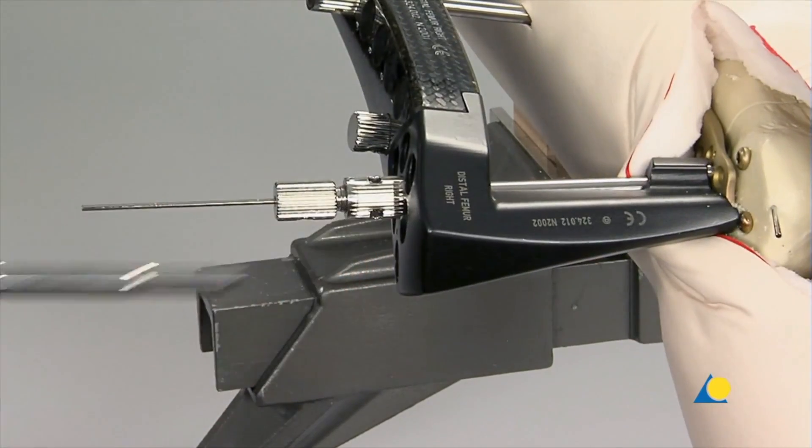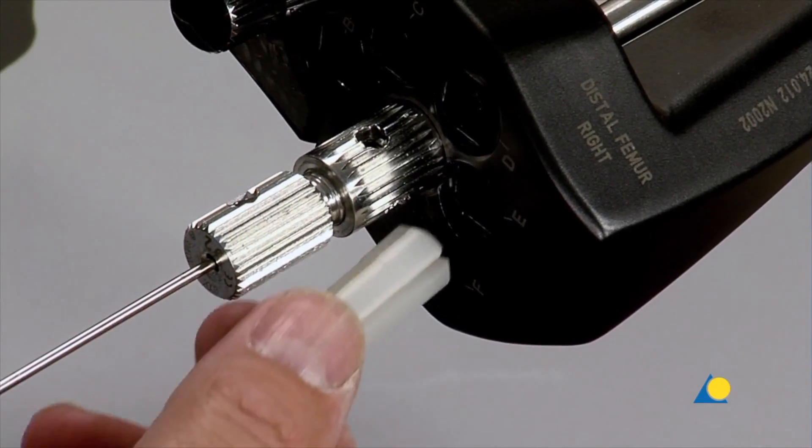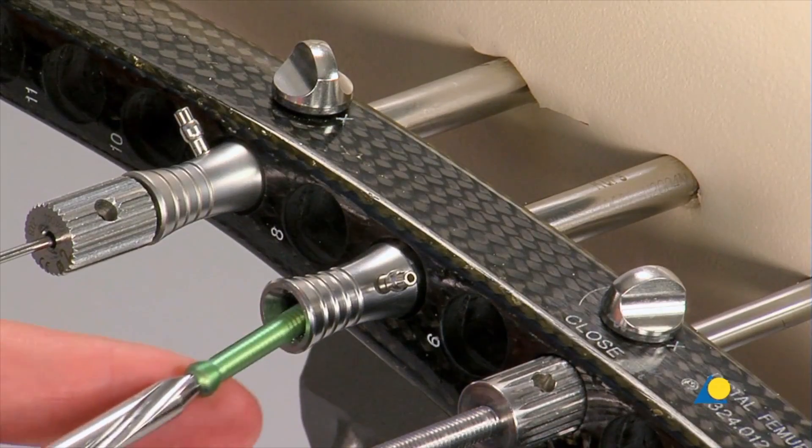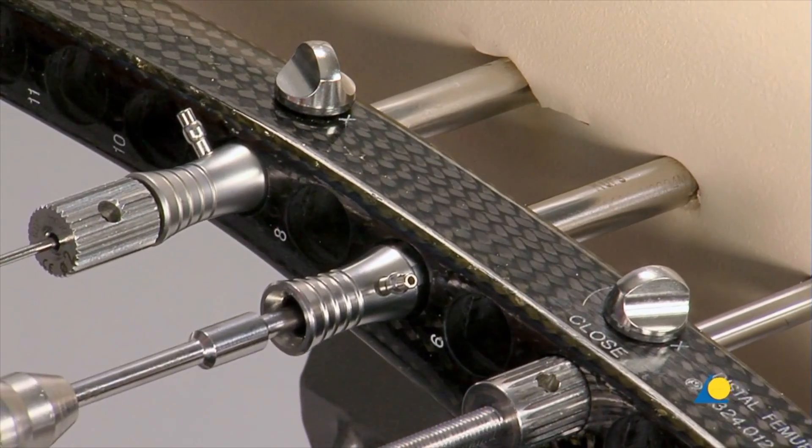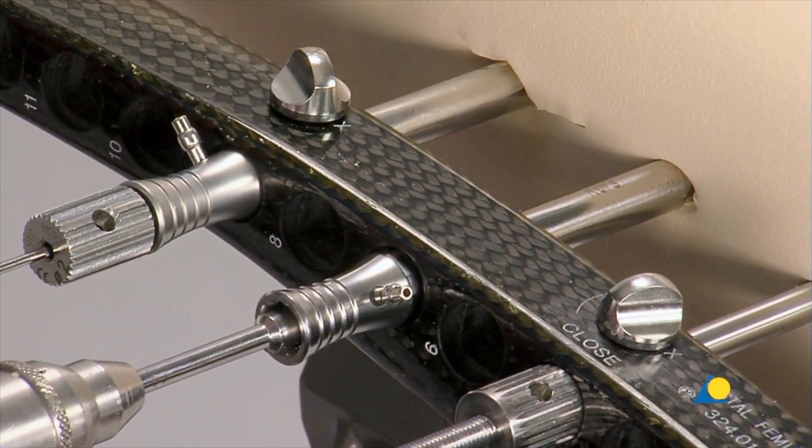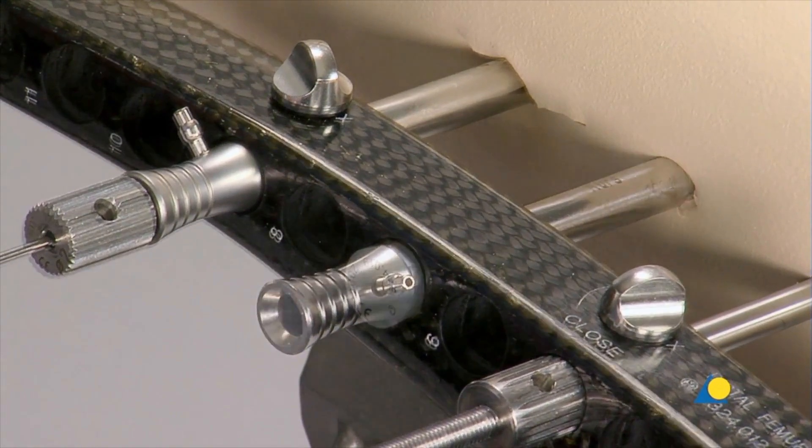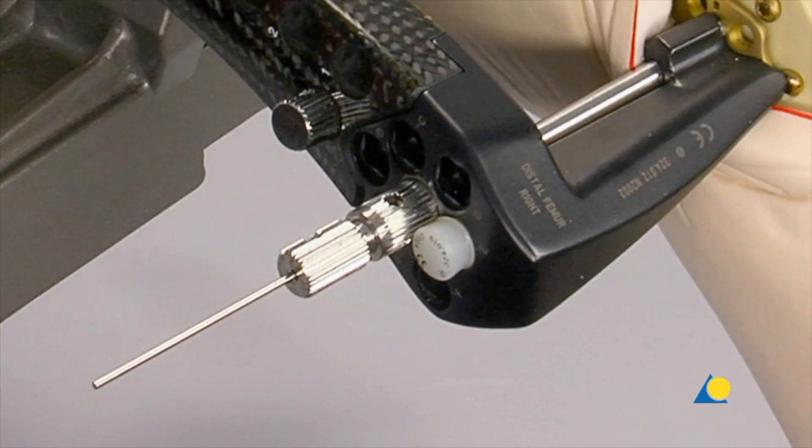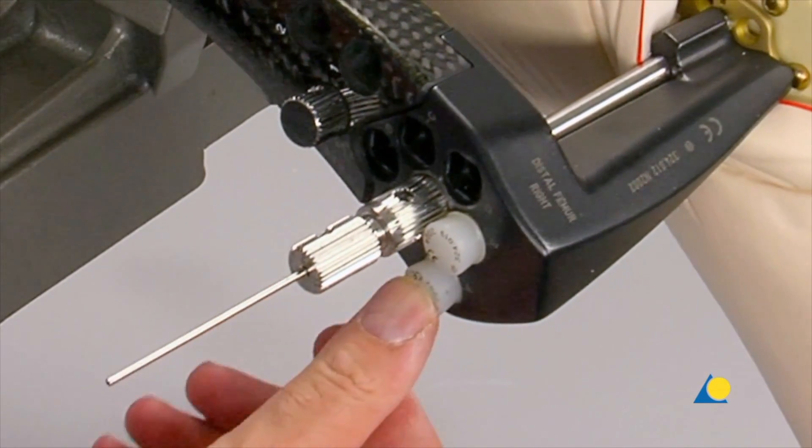The insertion sleeve is removed, and the filled hole is marked with a plastic stopper. A screw is now inserted through hole 7 in the usual manner, and the hole marked with a plastic stopper. A second distal screw is inserted through hole F and marked.